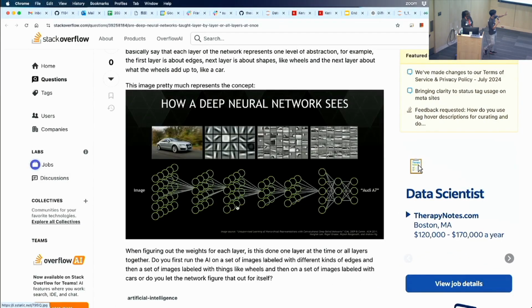Yeah, so this is what Harry's explaining. During the training process, our model will learn some basic features at the beginning, and then the features will become more and more meaningful concepts. Okay, so if we can freeze some layers, that means we don't have to retrain the model because they are just learning very basic edges or corners. Okay, so we can freeze maybe the first 10 layers and then train the other layers.